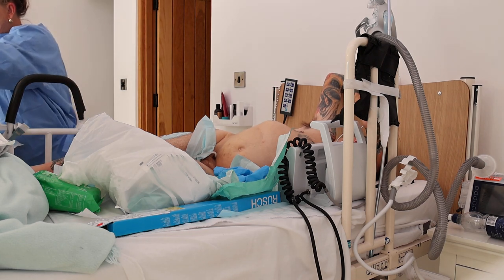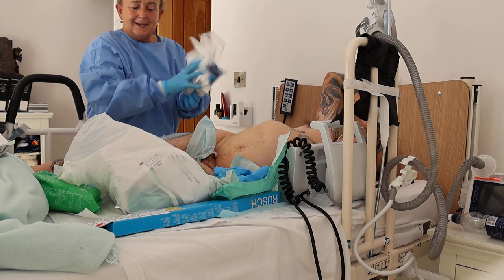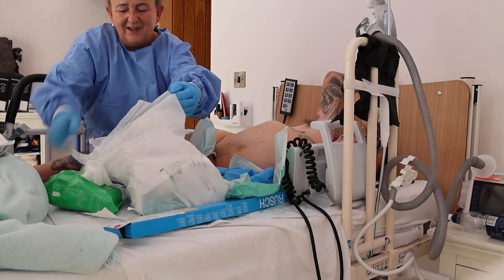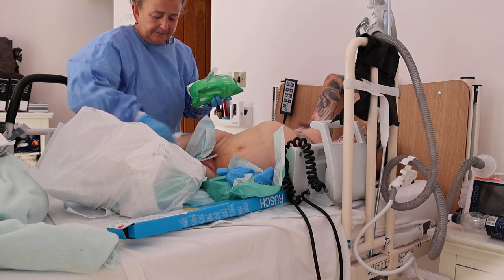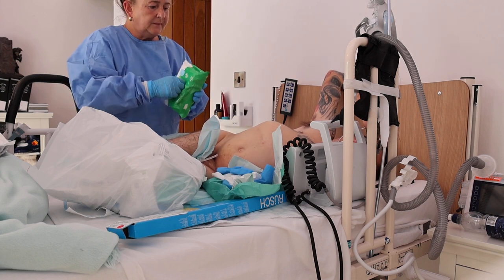So I keep all those. And as you can see, how are you feeling? I'm just going to have a look now downstairs while he's on camera. I'm leaving this bag in front so nobody gets to see anything. I'm just going to wipe his legs and wipe around them.